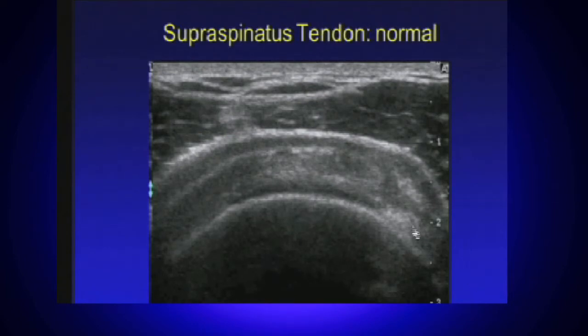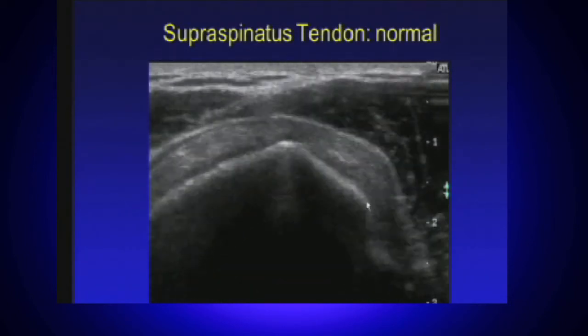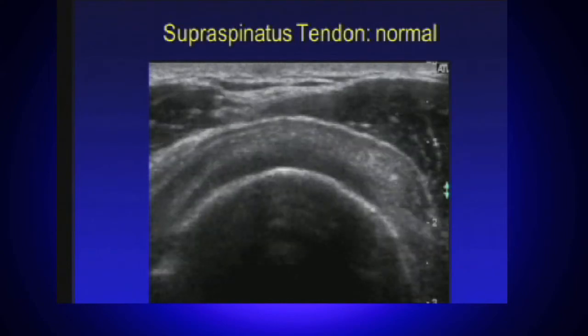So here's a video clip. Here the bursa is a little bit thick. That's not normal, that's abnormal. But I'm showing here in the video in a second, first of all, the humeral head, rotator interval, and we're going to leave the humeral head and we're going to get to the facets. So as we go distally, there we leave the hyaline cartilage, there's superior and middle facet. So you appreciate us going from the articular surface to the greater tuberosity surfaces.